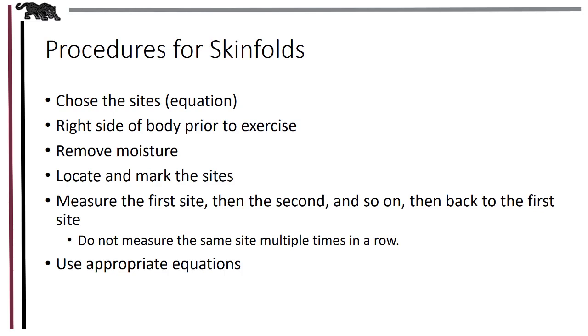And these are the standardized procedures for taking skinfolds. You're aware through lectures that there are many skinfold equations that can be used. Depending what you use, you have to follow the standardized procedure that was developed for that equation. Now we'll be following Jackson and Pollock, but most of them are generally the same as follows.